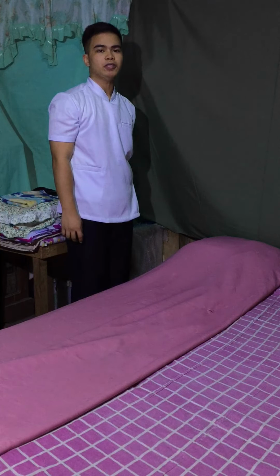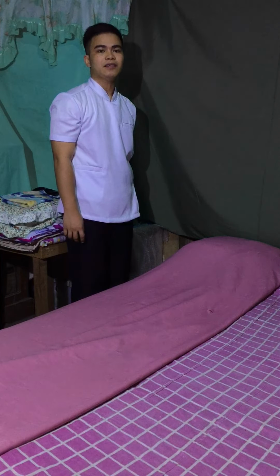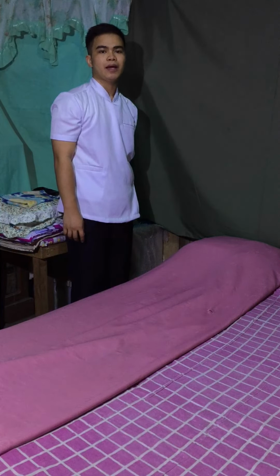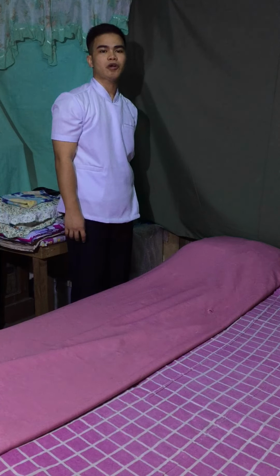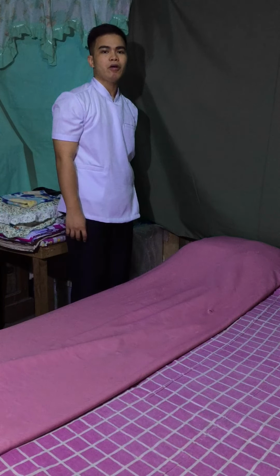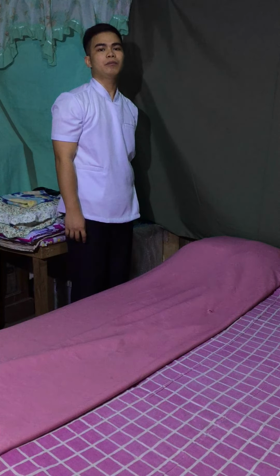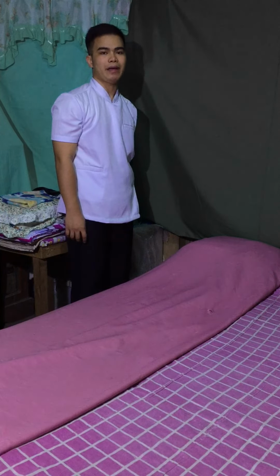Then, if waterproof draw sheet is used, place it over the bottom sheet so that the center fold is at the center line of the bed and the top and bottom edges extend from the middle of the patient's back to the area of the mid-thigh or knee. Unfold the uppermost half of the folded draw sheet at the center of the edge of the bed and tuck in the near edge. So, if the patient soils the bed, the draw sheet and pad can be changed without disturbing the bottom and top linens on the bed. Having all bottom linen in place before tucking them under the mattress avoids unnecessary moving about this bed. So, a draw sheet can aid moving the patient in bed.